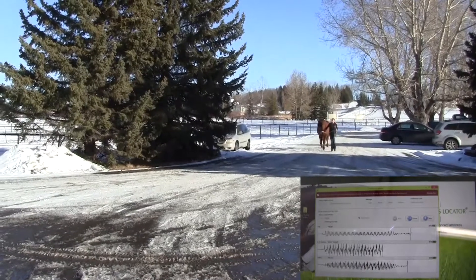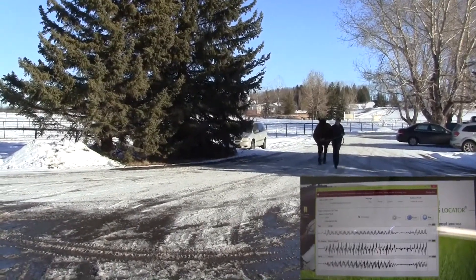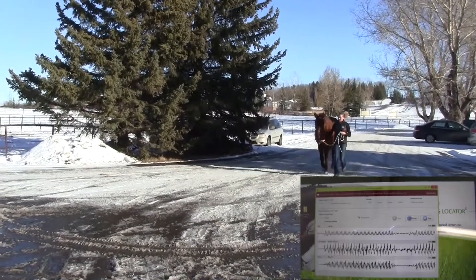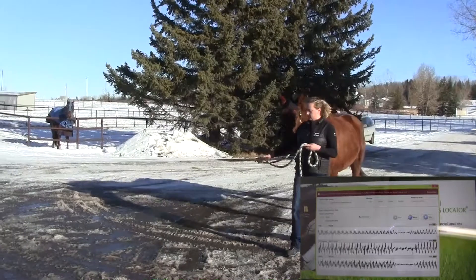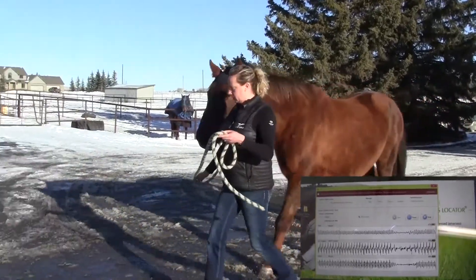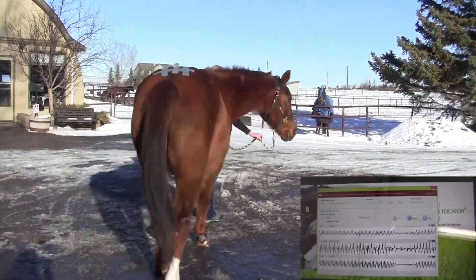When doing nerve blocks or joint blocks — placing local anesthetic in various locations to determine if the horse is better when it can't feel a certain part of its foot — the Lameness Locator will quantify the difference before and after the block, giving us an actual percentage improvement after the block.